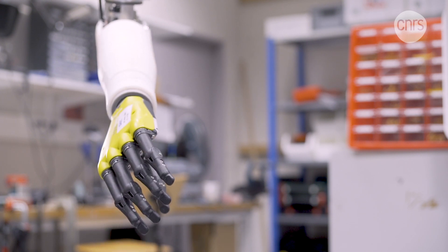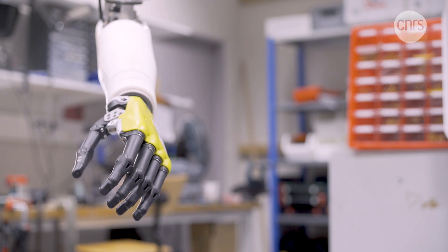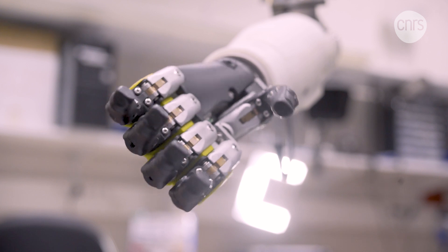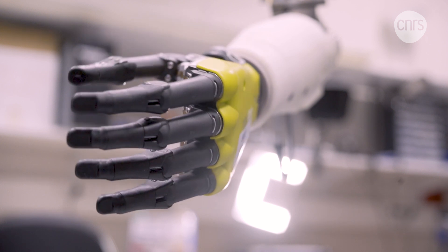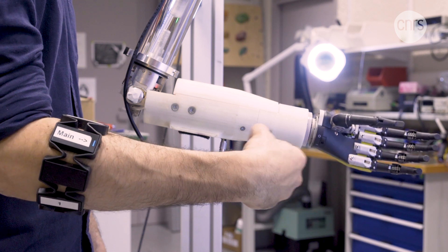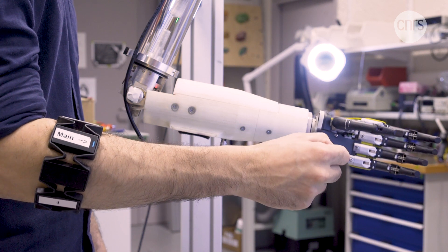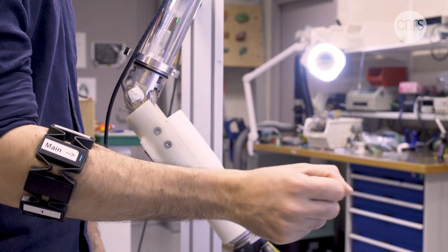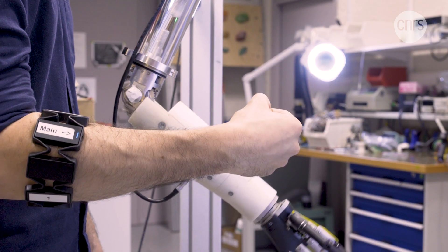The robotic prosthetic limb — a seemingly ideal solution for those who have lost an arm to amputation. Even though technological progress has led to high-performance prosthetics, it isn't enough. The controls need to be more natural, and the actual manner in which they're controlled requires too much effort for many of their users.